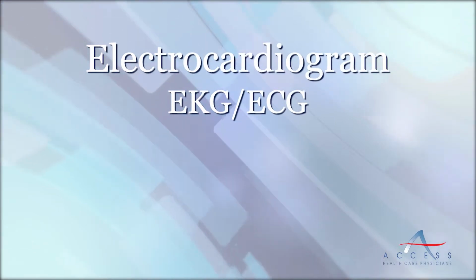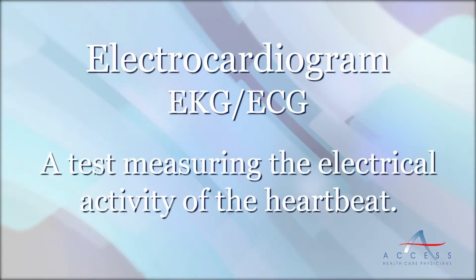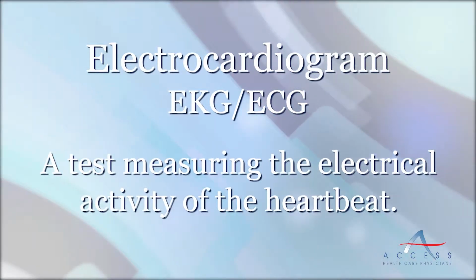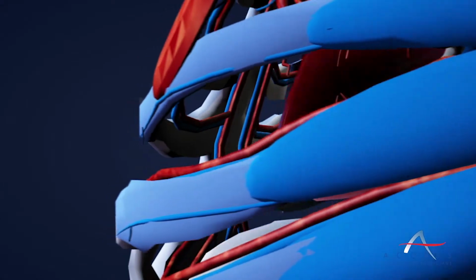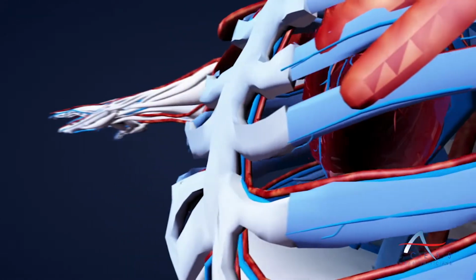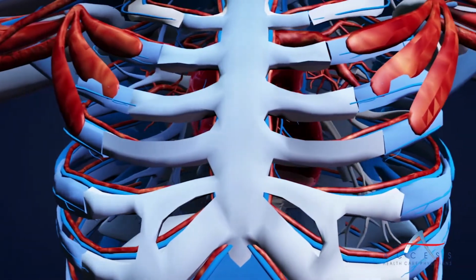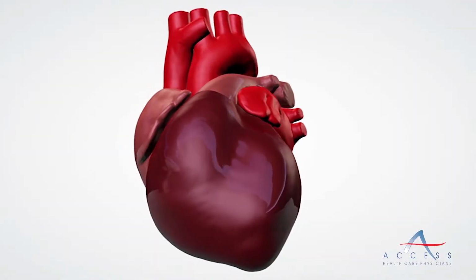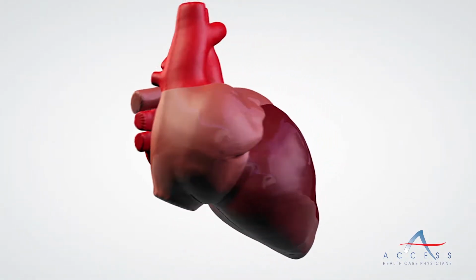An electrocardiogram, abbreviated as EKG or ECG, is a test that measures the electrical activity of the heartbeat. With each beat, an electrical impulse, or wave, travels through the heart. This wave causes the muscle to squeeze and pump the blood from the heart. A heartbeat on an EKG will show the timing of the upper and lower chambers.